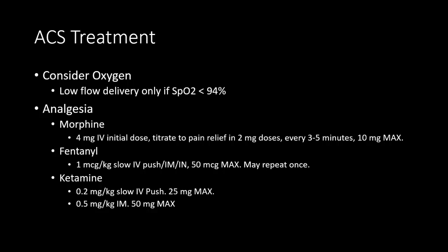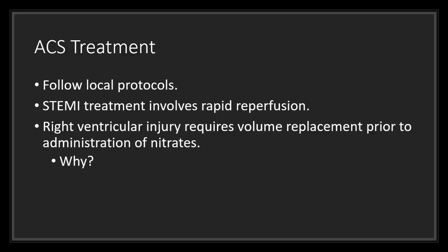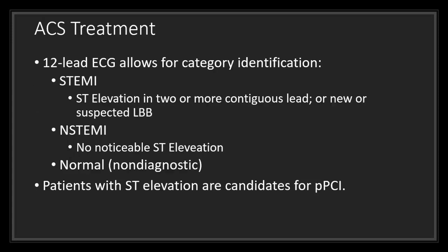But as always, follow your local protocols, your local standards of treatment, and make sure that you are in compliance with that. It's very important as a paramedic for you to understand that STEMI treatment involves rapid reperfusion, which is going to involve rapid identification. So you've got 3 categories here with chest pain. You've got STEMI, you've got non-STEMI, and you've got a normal or a non-diagnostic.